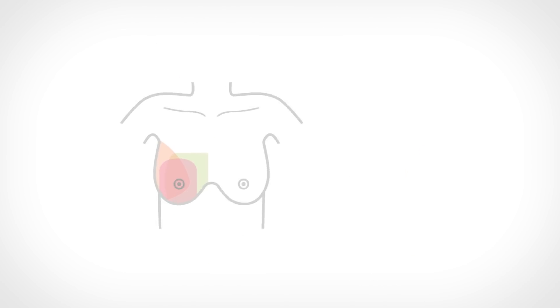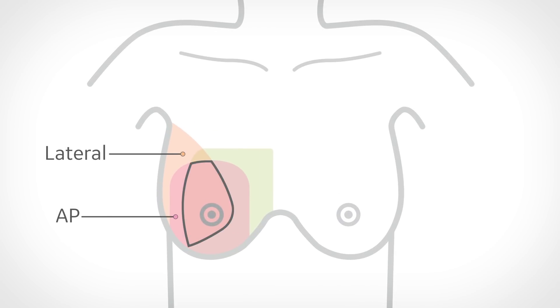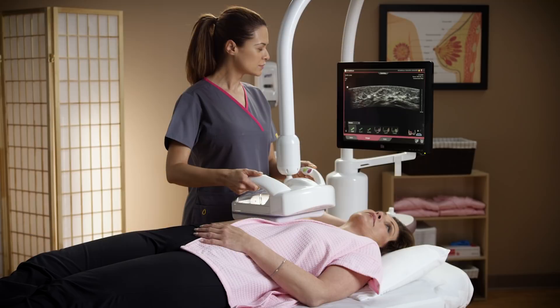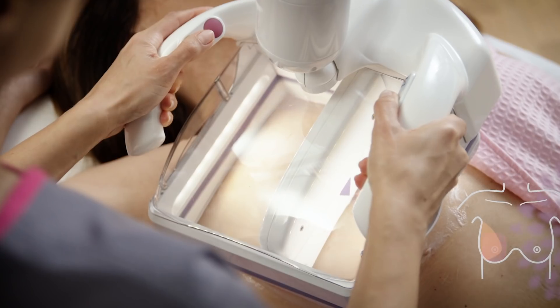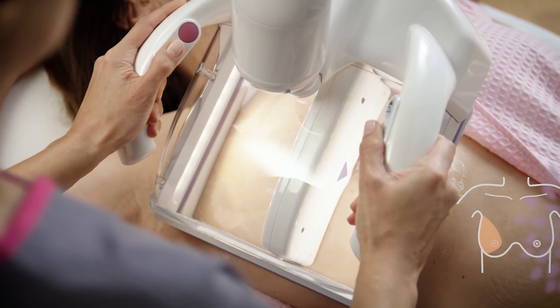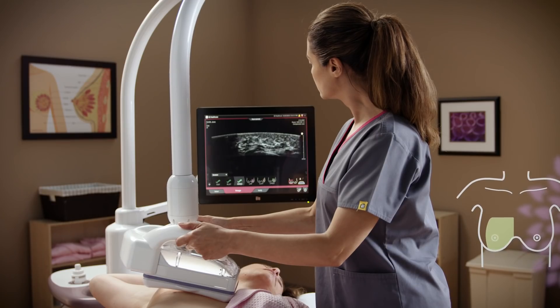The typical Invenia ABUS 2.0 exam consists of three views or volumes. Six volumes are acquired for a full exam, three per breast. These volumes overlap, allowing for additional coverage of the central aspect of the breast where typically the denser cone of breast tissue exists. Routinely, the volumes will include a centrally located anterior-posterior AP and AP projections of both the lateral and medial aspects of the breast.